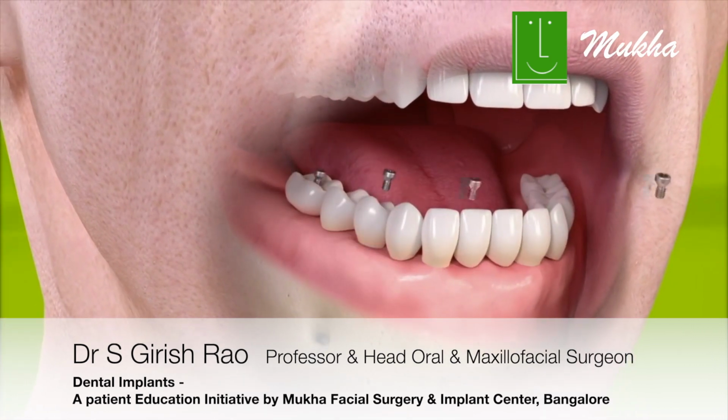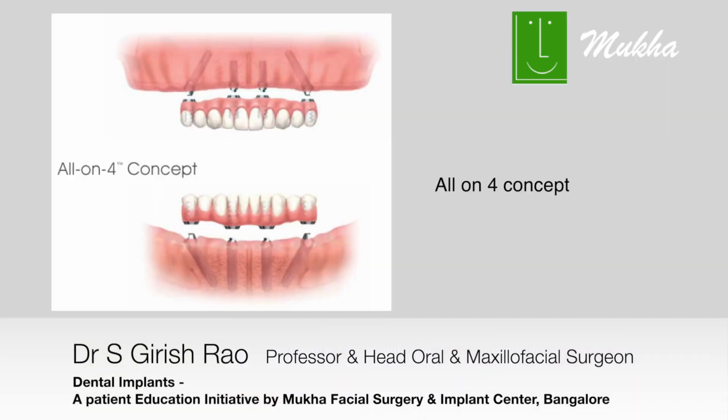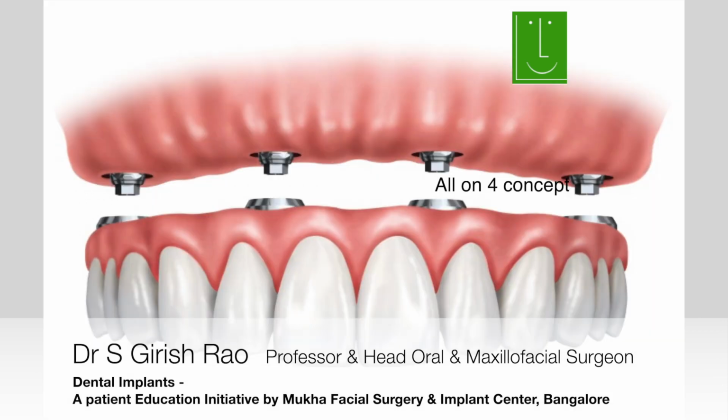However, with newer technologies coming in, we have a concept called the all-on-4 concept, where we tilt the last implants at an angulation. The two central implants are straight and parallel, while the distal or the last implants in the mouth are slightly at an angle. Based on this, we can give a full bridge having about 12 teeth on your 4 implants.